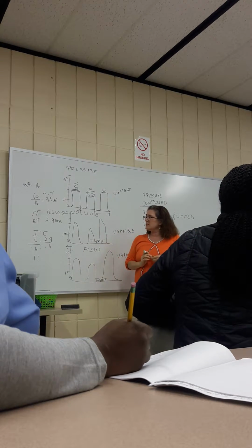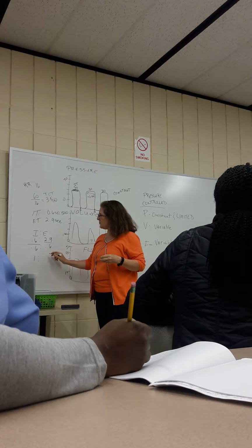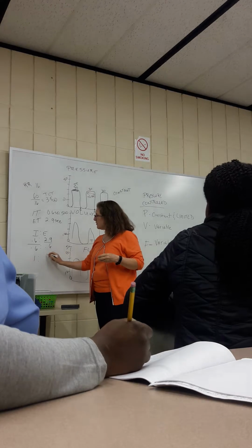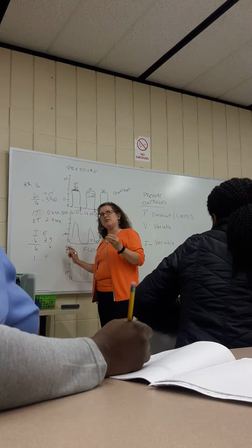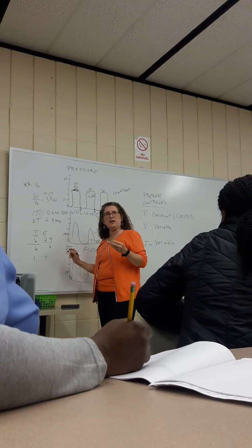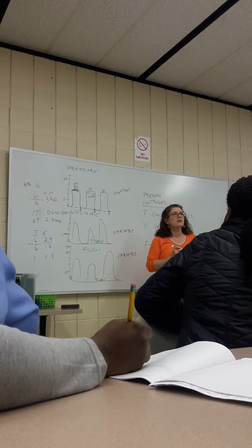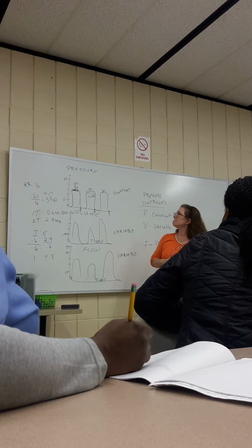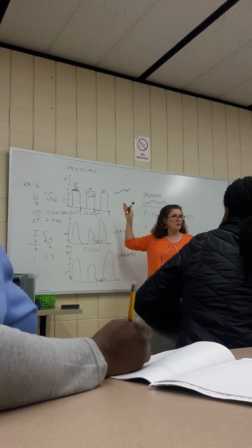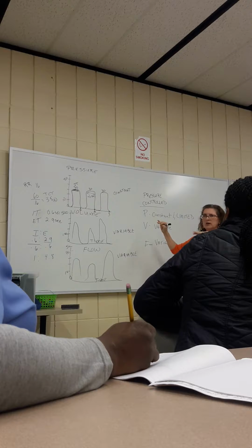So 6 goes into 29, probably close to 4. 6 into 29 is 4, 24, 5 left over, 6 into 58, so 1 to 4.8 roughly. So that's pressure control.